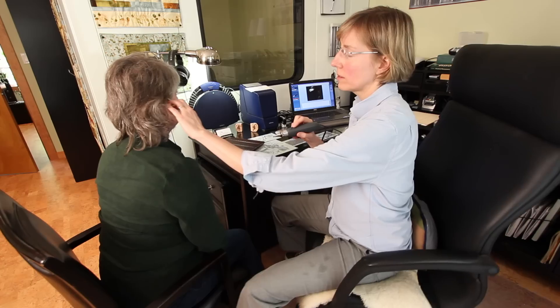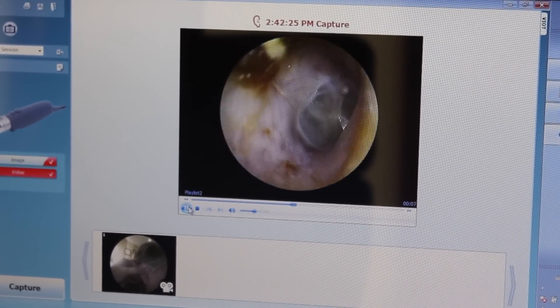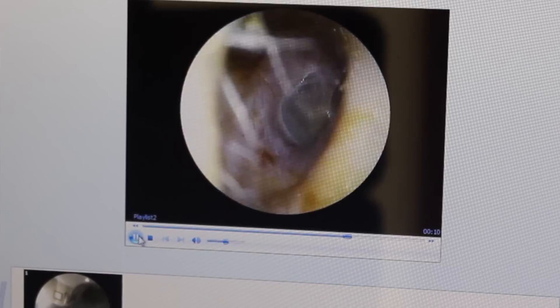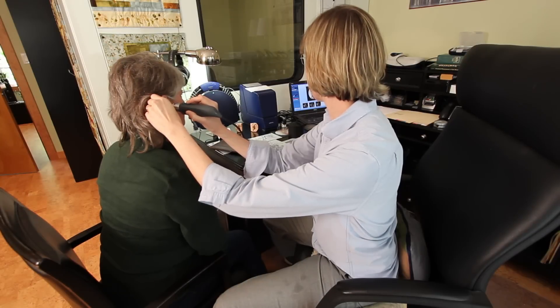So I'm just going to have a look now. Can you see the monitor here? We look here and then we have a nice clear view. Before we had a little pile of wax just at the entrance of your canal. Now I've left some wax because it's there to protect your ear.